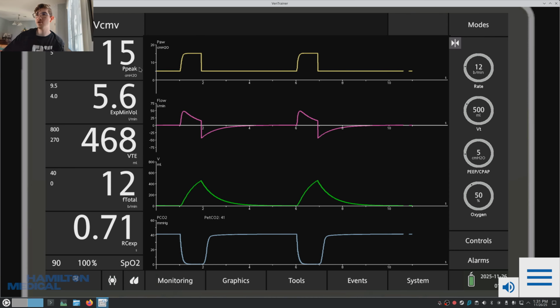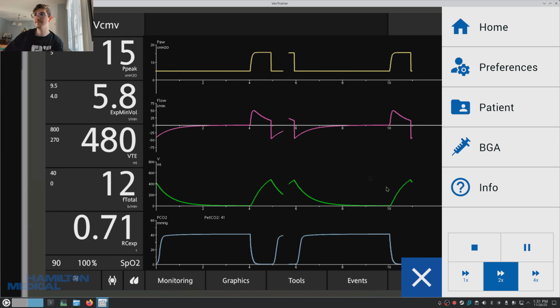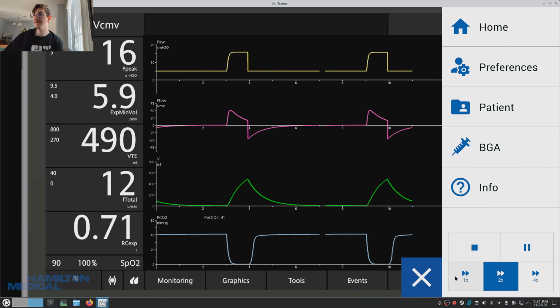Okay? And now what it should do is it should titrate up a little bit more to try to get back to 500. Watch this. In a few breaths, it'll do it. I promise. Promise. There we go, 16. Yeah, okay.